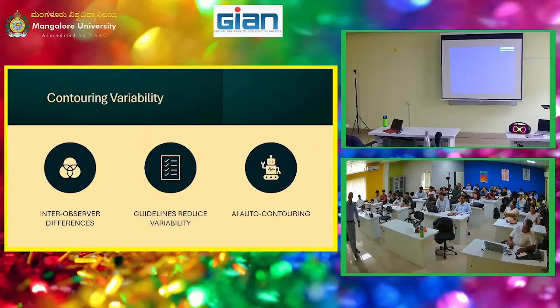So what we're doing here is we're reading the scans, those CT scans, for identification of the tumor, and then we ask them to segment it. And then those segmentations are taken by the planning team, and they're going to draw the margins, the planning margin. Correct? So why am I bringing this up?